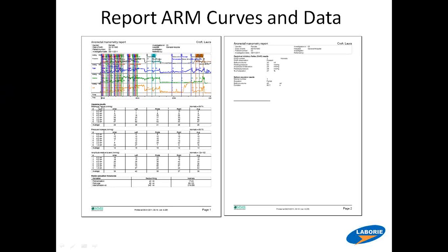And the numbers measure the resting. And I know this says squeeze, but that's wrong. I always cross that out. This is resting pressures. And you can get a pressure increase, which is the differential between the rest and squeeze. But I really need to look at this one for squeezing amplitude relative to 0. So I'll look at the summary here, the averages. I'll look at the maximum average, here 47 for the resting.